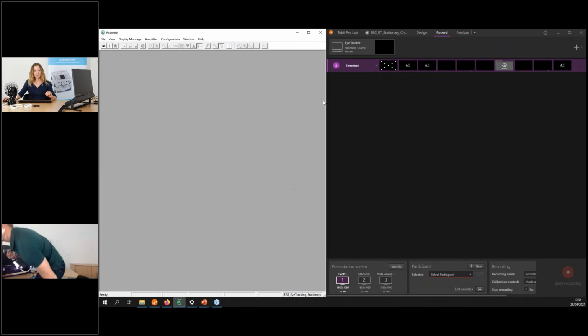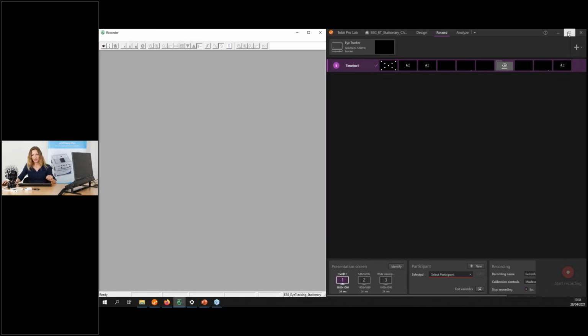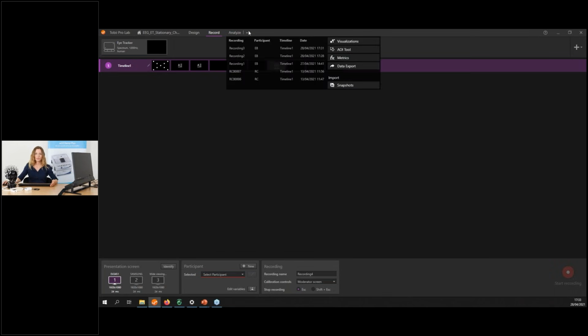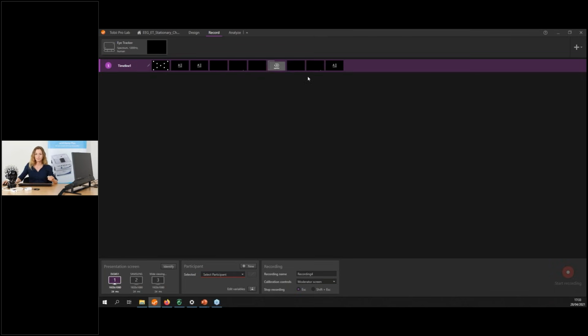Okay, I'll stop the recorder here. While the others are wrapping up, we stop sharing the camera. Let us jump to Tobii Pro Lab and to the analysis part. Pro Lab has this Analyze tab here, and I can see all the recordings that I've previously performed in this project file. So what I want to do now is analyze some pre-recorded data.